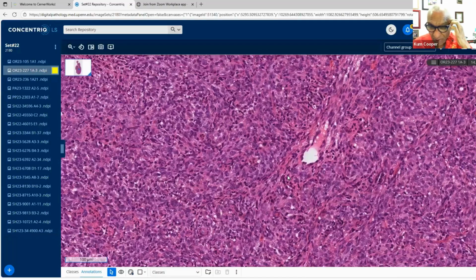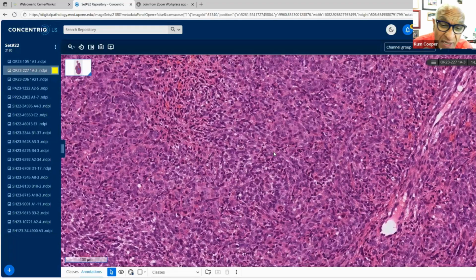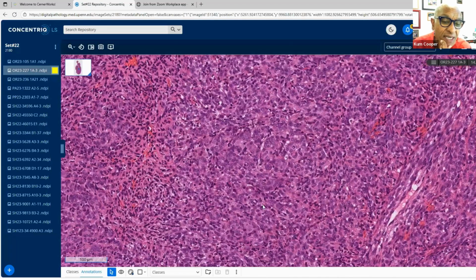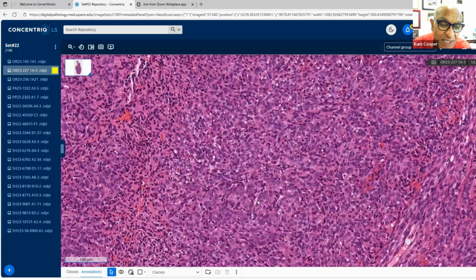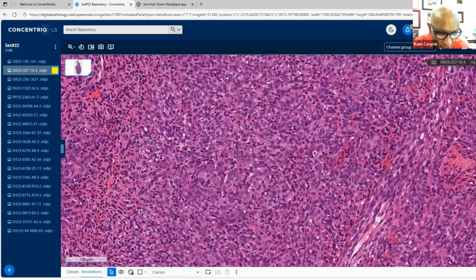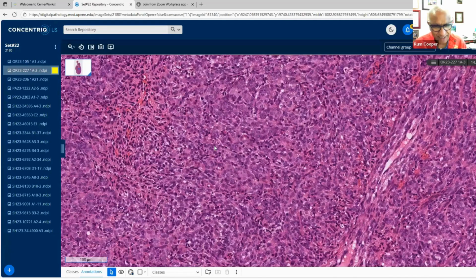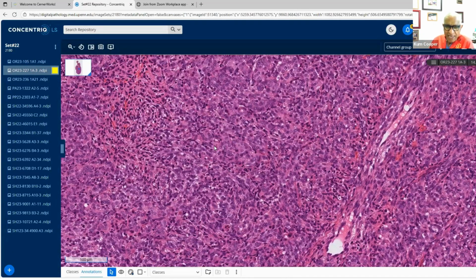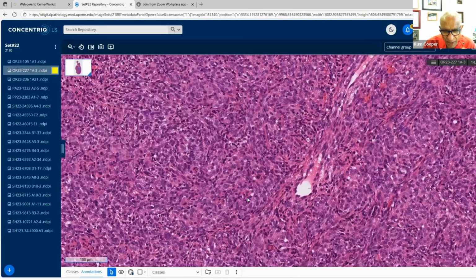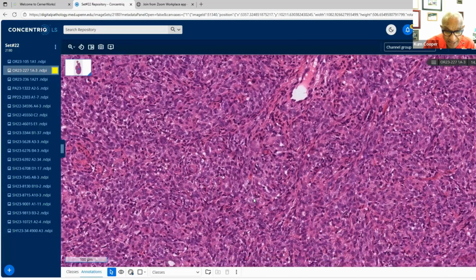Okay, we have the epithelial markers positive. You can use the hormonal markers, ER, PR, they're variably positive. But the other two groups of markers that I like to think about when I'm thinking of UTROSCT are mesenchymal markers. And in this context, we're thinking of smooth muscle markers. So desmin is also positive in a good percentage of UTROSCTs, but also the ovarian sex cord stromal markers like SF1, steroidogenic factor 1, and inhibin. Inhibin is another marker. So having all three markers with this kind of varied morphology is useful to make that diagnosis. And yes, I did call it a UTROSCT.